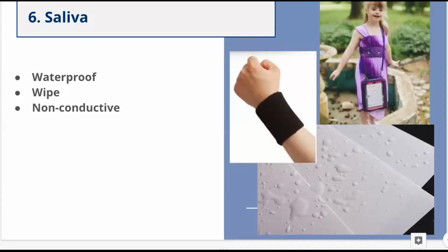The other one that I'm showcasing here is a chat bag. There's a protective screen layer on the top that doesn't prevent your access, but at least it makes it super wipeable. I've also used Uline bags in a pinch. They're really hardy, they're inexpensive. You can poke a couple of holes in the corners and put little key rings on them to add a strap if you want. If you get a nice heavy duty Uline bag, which you might find in your office buildings.